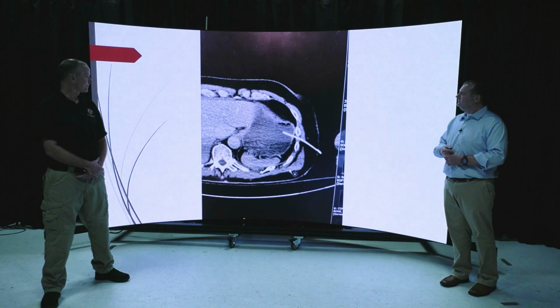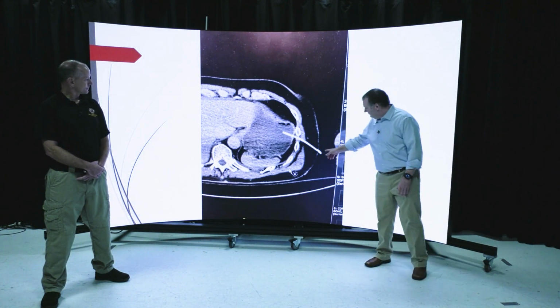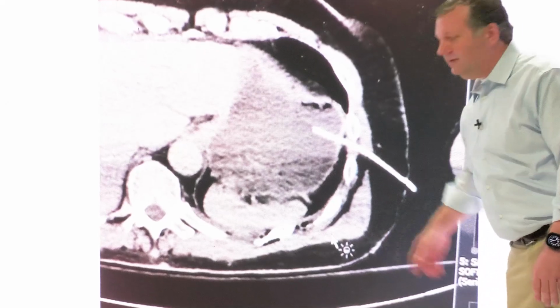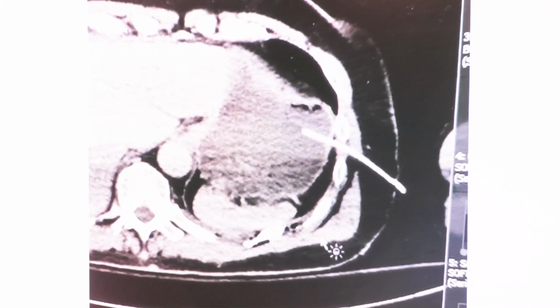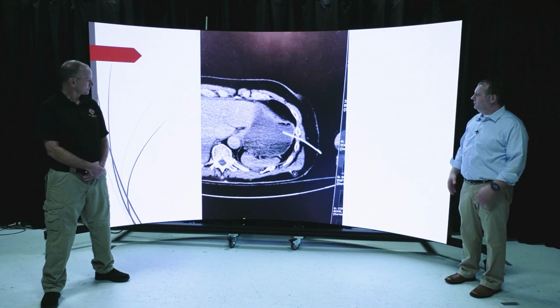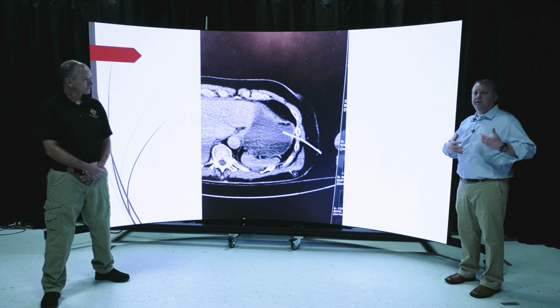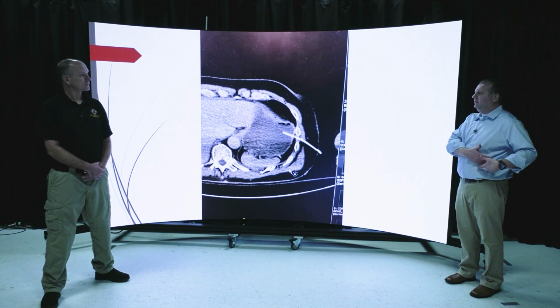So, yeah. This is a picture of a lateral decompression here, if you can follow the catheter as it goes into the stomach. This is one of the patients who unfortunately had to go to the OR because of this. It's something that we want to prevent, and in this situation the paramedic was too low in the decompression. I think a lot of us don't realize how high up the fifth intercostal space is, because you're really about the nipple line or slightly above it.